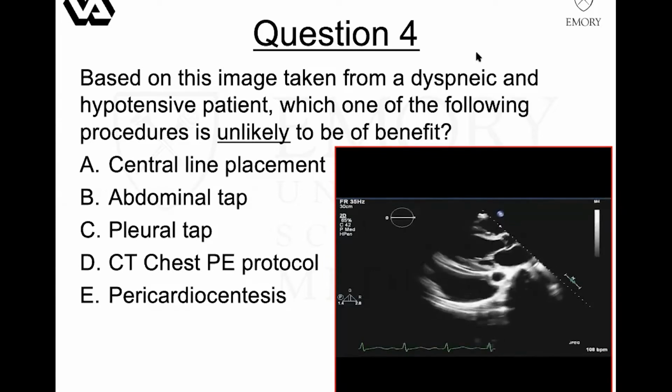Unlikely that pericardiocentesis would be helpful. Good. So I think everyone needs to realize something that Marcelo is trying to point out here. If you look, this is the descending thoracic aorta, this is the vertebral body, and this, oh, you all can't see whatever I'm pointing at, can you?